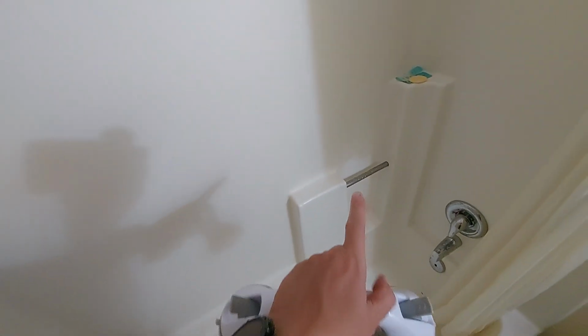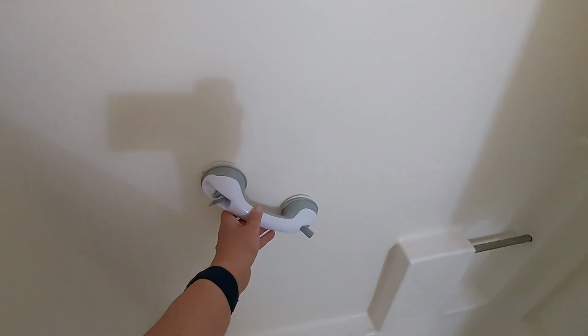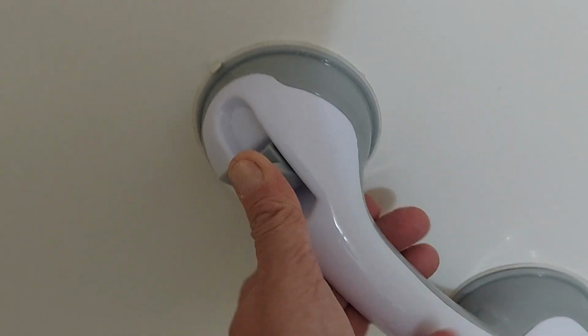Now this shower, as you can see in this hotel, has a handle here, but it's really not in a good spot for where we need it. So I think I'm going to put it here. And when we do that, we can just push down.